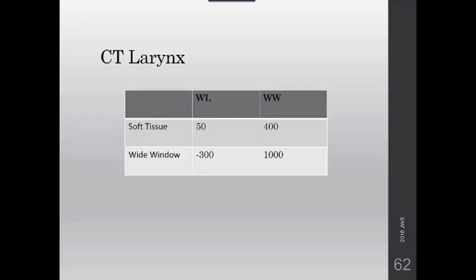The images in DeMaio depict 2 stages of scanning: quiet breathing and phonation, with images submitted in the soft tissue window and also in that wide window. You'll definitely need to utilize multiplanar reformats in the coronal and sagittal planes for this study.